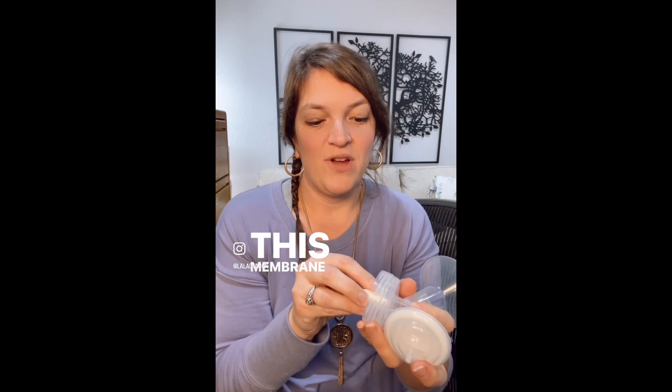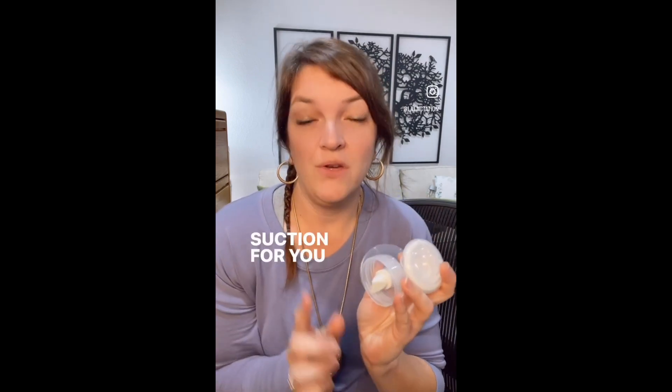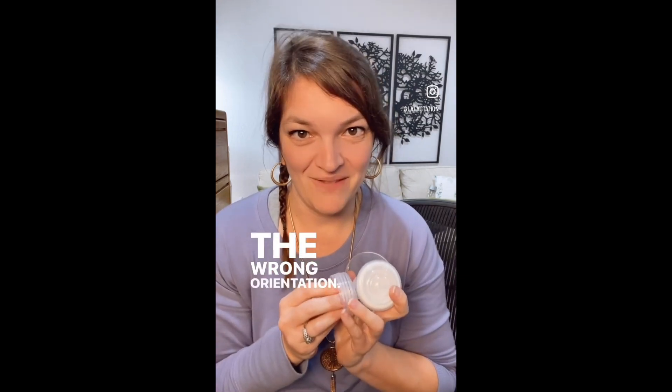This membrane will fit inside and should create better suction for you without the malfunction risk of having it in the wrong orientation. Now you know.